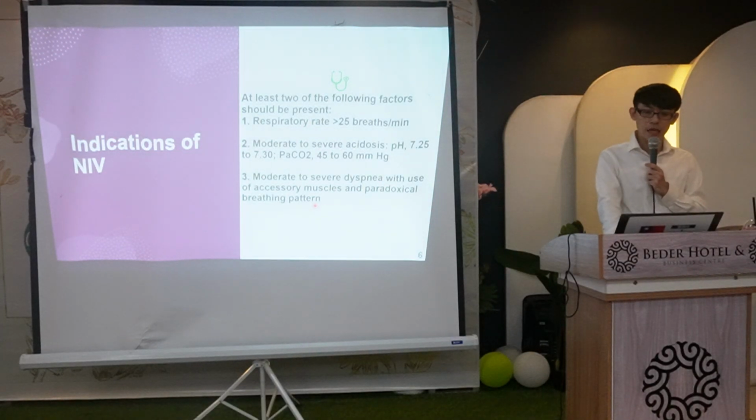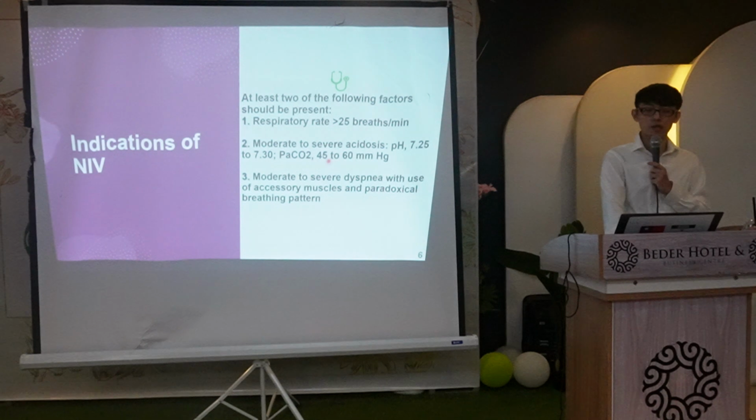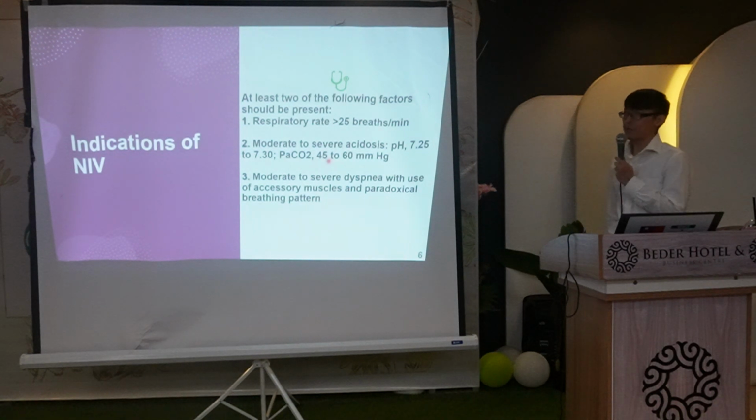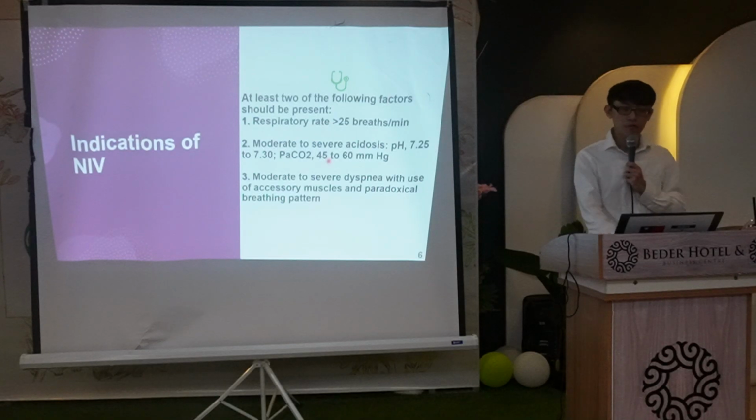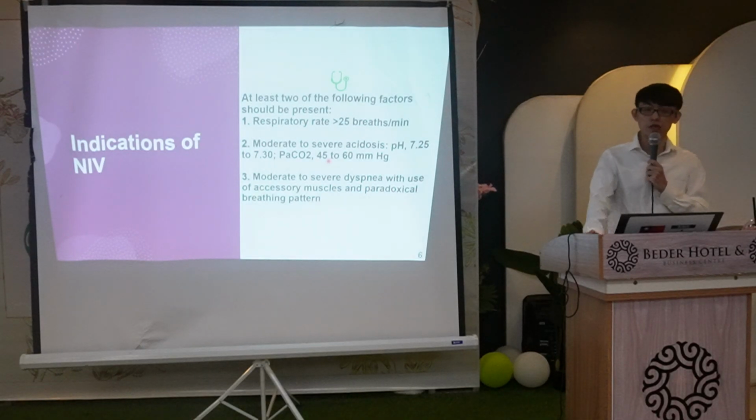The other thing is gas exchange: acidosis, pH decrease, and CO2 increase. It's like a hypercapnic respiratory failure, or what we call impending hypercapnic respiratory failure. Maybe the patient just meets 1 to 2 criteria, and this is your indication to use NIV.